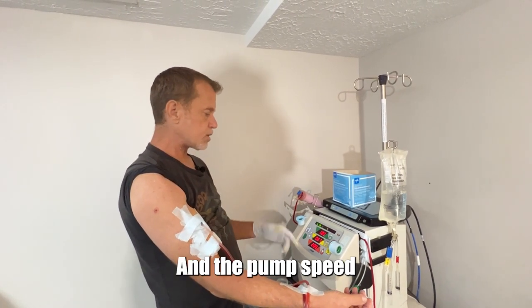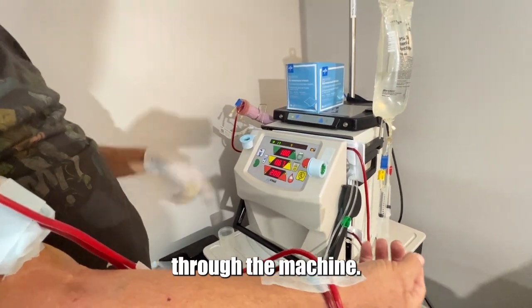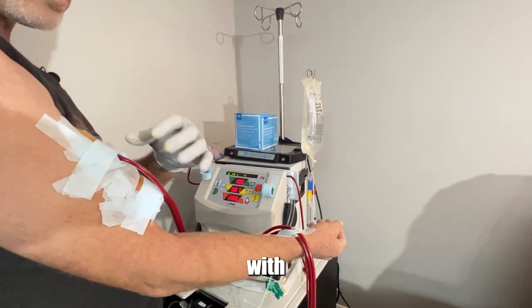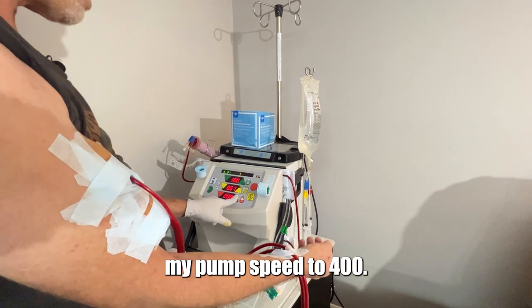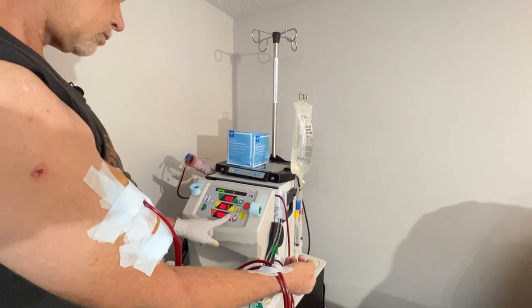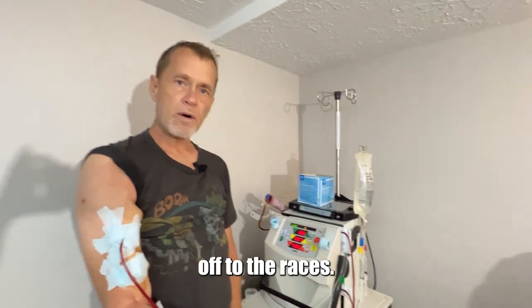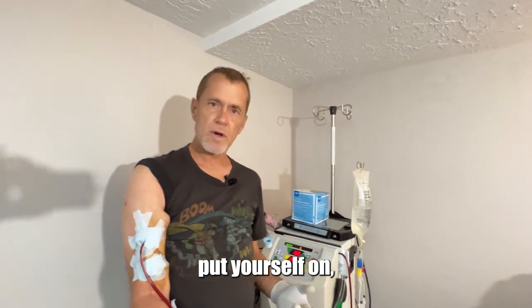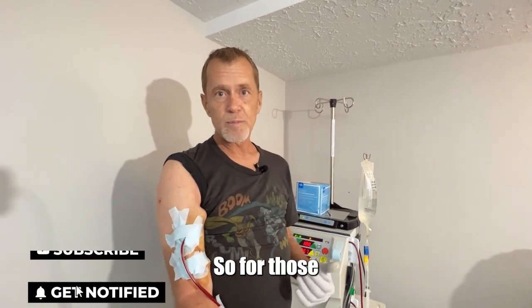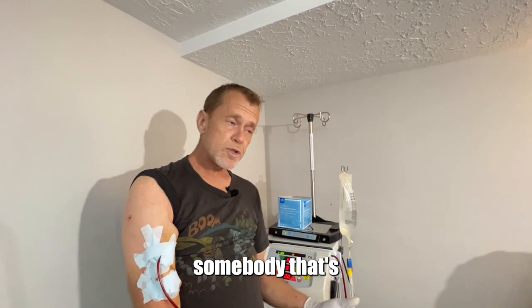Now I'm making sure we're off to a good start — no alarms. The pump speed starts off at 200. Pump speed is the speed at which it forces the blood through the machine. You want a high enough pump speed to get good filtration, but not so high that it causes issues with too much pressure in the fistula. I'm going to increase my pump speed to 400. Fluid is set, pump speed is at 400, and we are off to the races. This is step-by-step how you put yourself on, including self-cannulation and getting yourself connected. It's actually really easy once you get used to it. For those of you considering it, take a look at this, leave comments if you have any questions, and if you know somebody going through kidney disease, share this video with them.